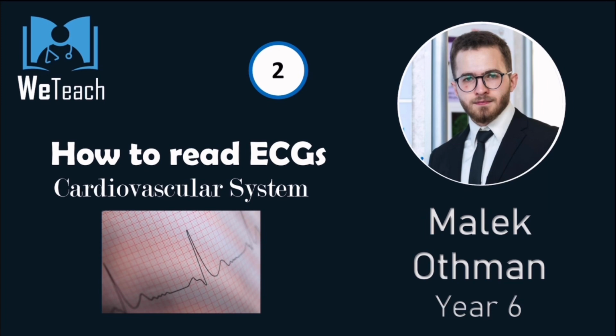Hi everyone. One of the challenging topics that Year 2 students face is how to read ECGs, especially during exams. So today I will give you a systematic way to report your ECG findings.